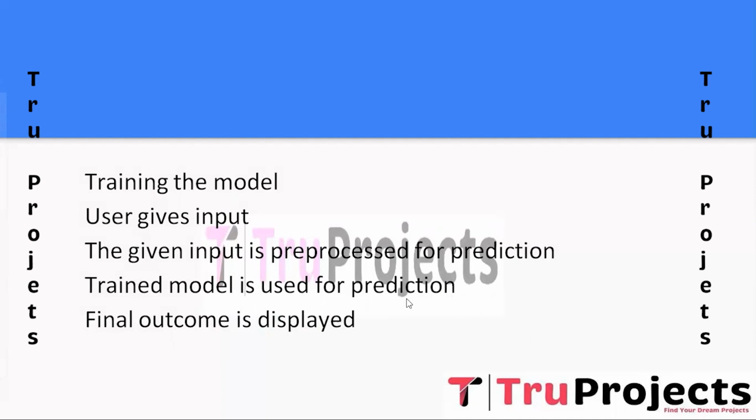Each model predicts the likelihood of the input image containing the sign of glaucoma. And the last step is that the final outcome is displayed. The predictions from all three models are collected and analyzed depending on the chosen ensemble method.